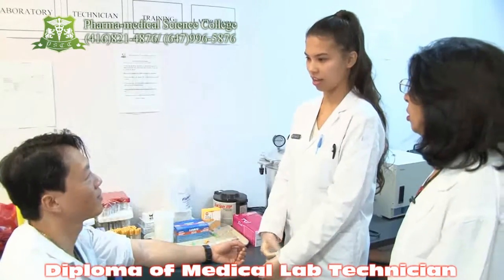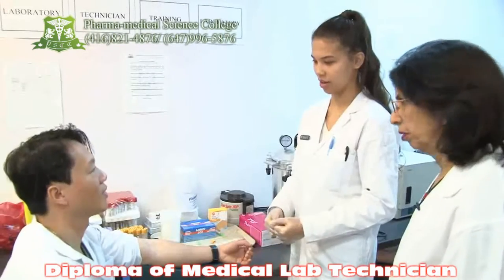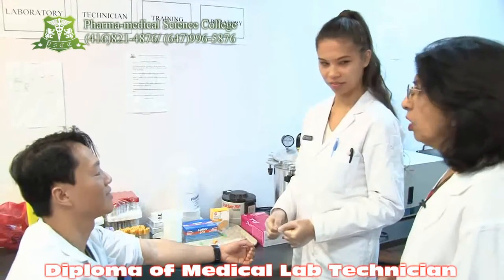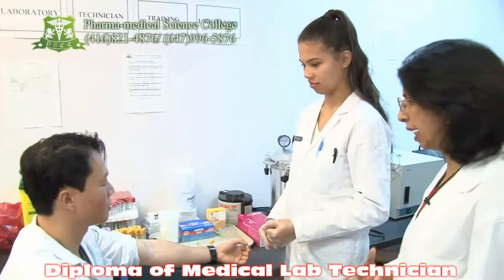Hi, my name is Rizal. I'll be taking your blood today. Can I please see your health card? What's your name? So two patient identifications have been taken to confirm the patient's identity.